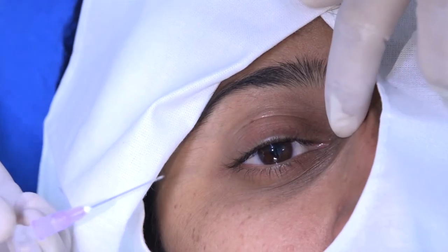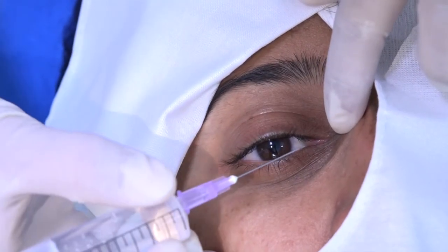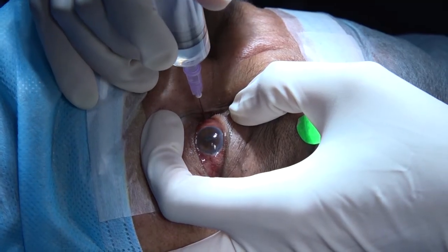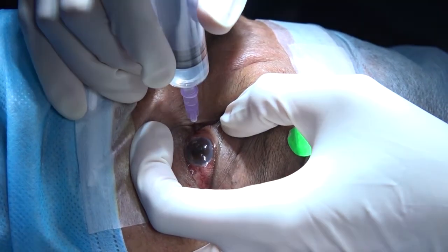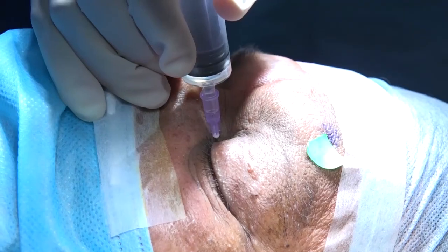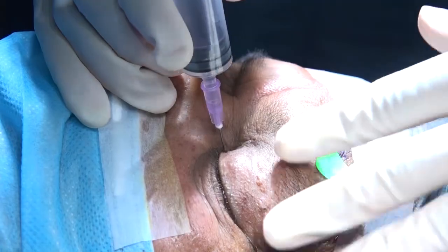For giving a nasociliary or anterior ethmoidal nerve block, the needle is inserted parallel to the medial wall of the orbit, about 2 cm posterior to the anterior lacrimal crest, corresponding to the anterior ethmoidal foramen.